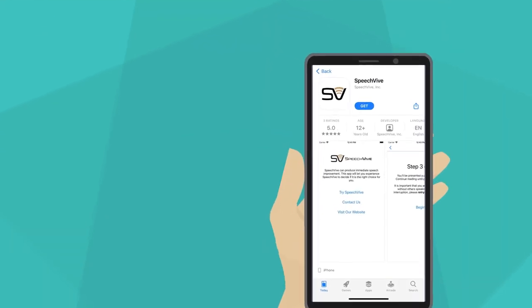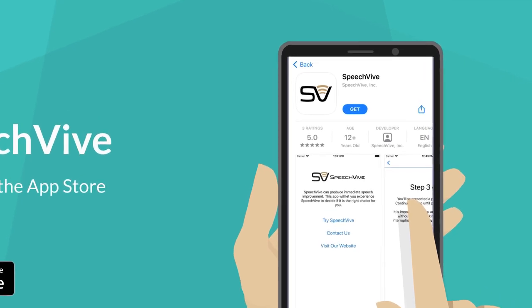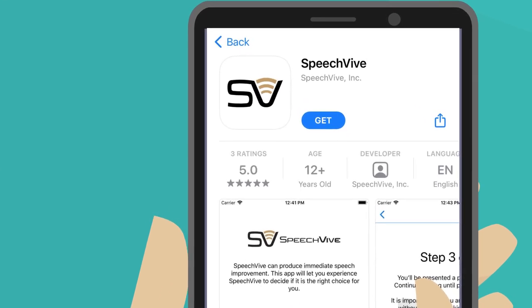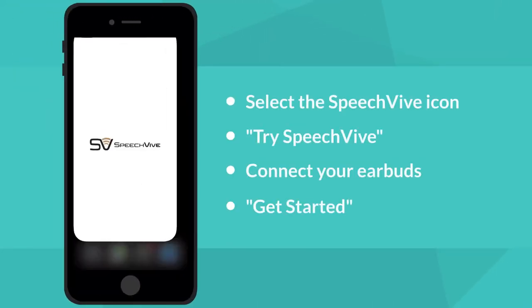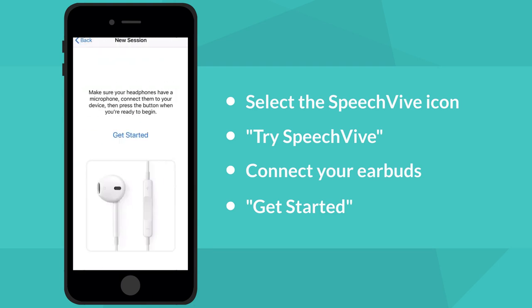When you're ready to get started, search SpeechVive in the Apple App Store on your device. Select Get. If you're using an iPad and it doesn't show up, change your filter settings to include iPad and iPhone device selection. Open the SpeechVive app by selecting the icon. Press Try SpeechVive and connect your earbuds, then press Get Started.